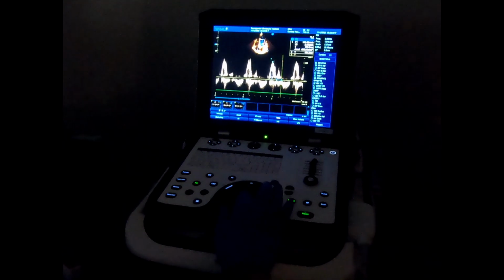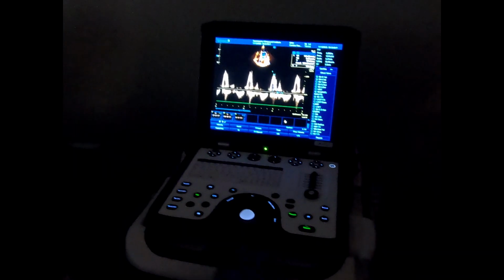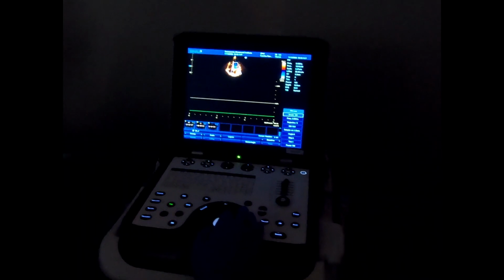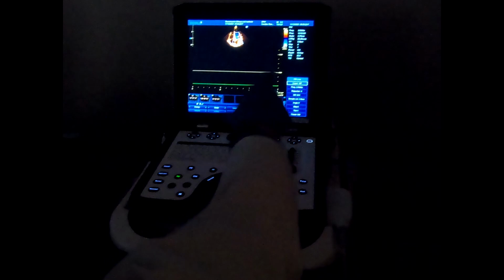Always the time is within the baseline. See that little... that's cool. Sorry, I just wanna make sure: deceleration time and pressure half time are slope measurements, but the duration is a time measurement. Yes. And if you deactivate your package, these will be activated, and you can choose the time to measure.